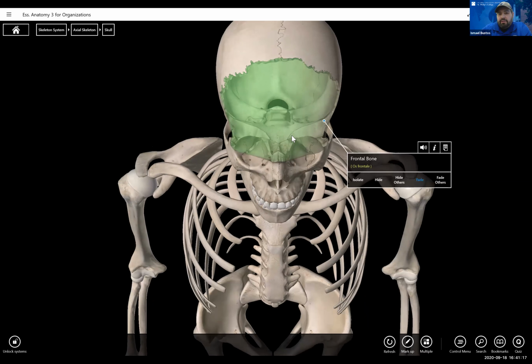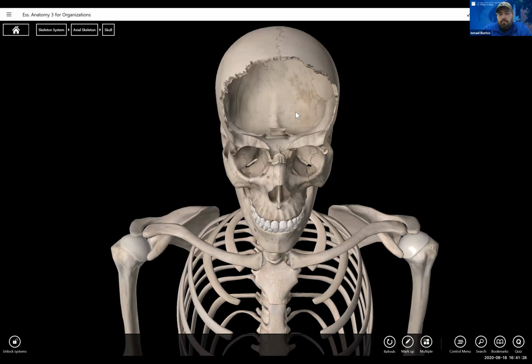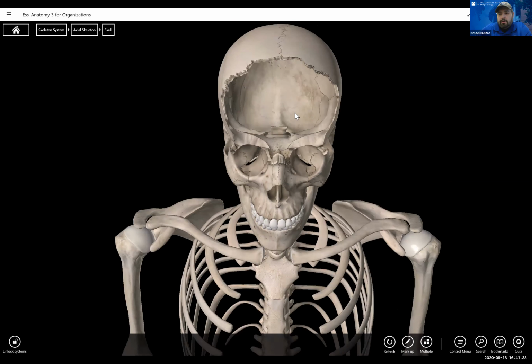If there's not enough angle between the CR and the OML, then it goes like that. So again, too much angle or too much flexion right here, not enough angle, not enough flexion.